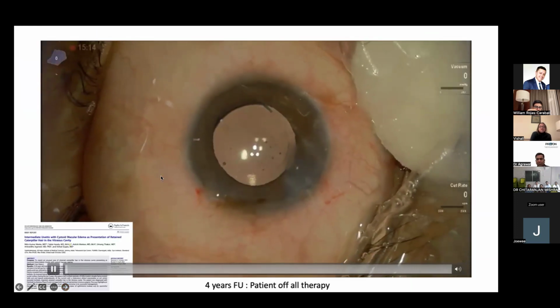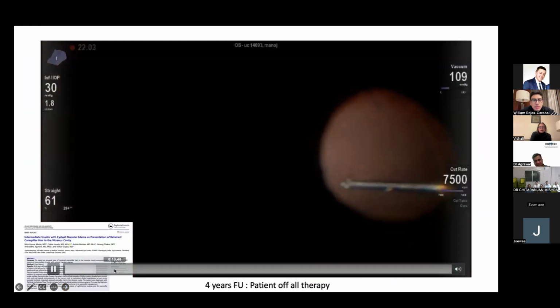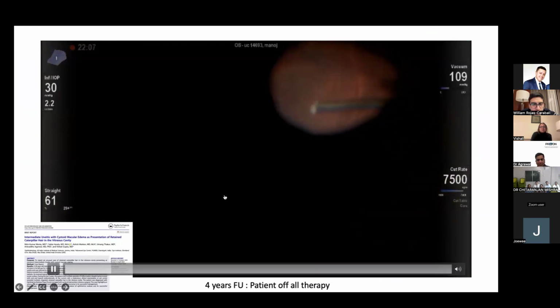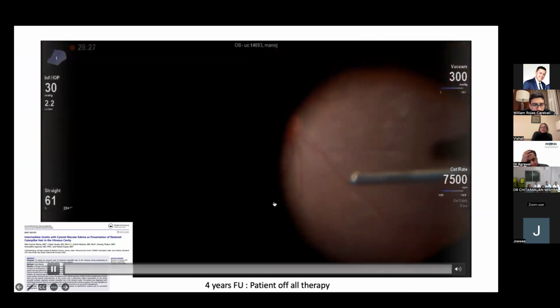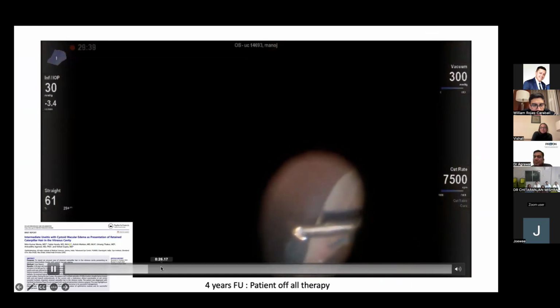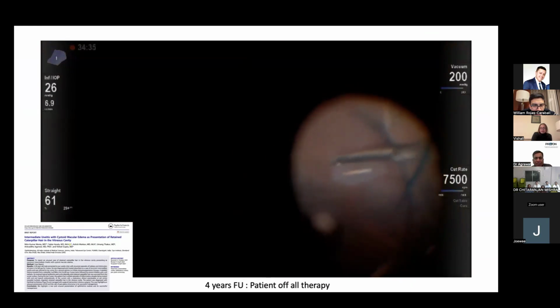And this is just to confirm that what I'm talking is actually true. I did the surgery for him. He had cataract also. So first we removed the cataract and then, as you can see, cleared the vitreous, which had few debris. And most of these here are located in the periphery.